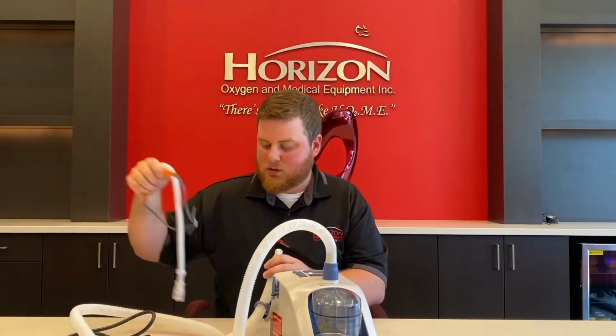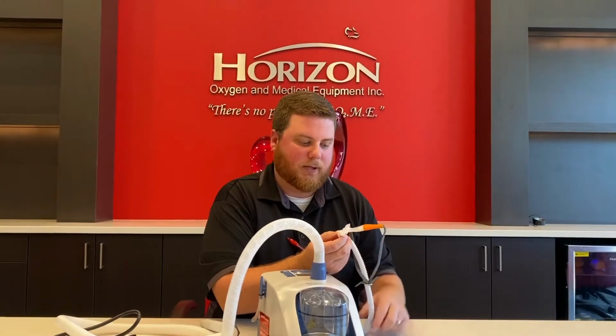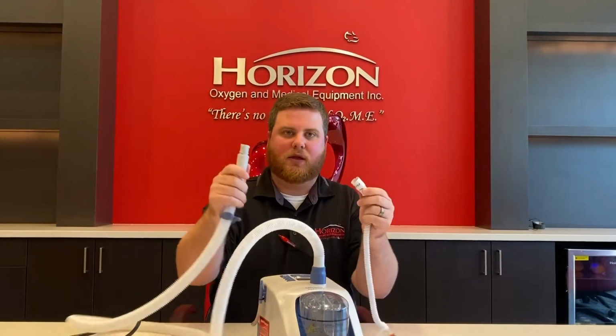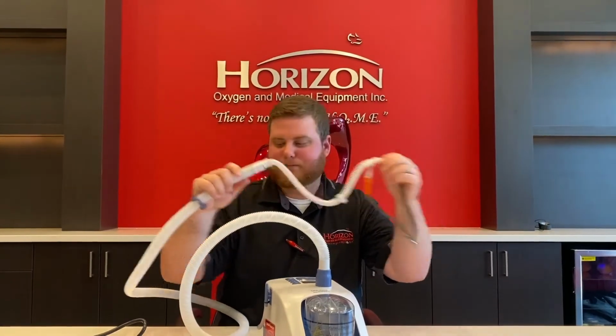Now, we can use this for most patients. They're going to utilize what's called the OptiFlow. There's a small, medium, and large: an orange one, a blue one, and a green one. The change in size is based on the size of the prong to the patient. This OptiFlow fits perfectly with the end of the tubing that comes with the Airvo. So we'll slide those in together, that snaps into place, and then we can put this onto the patient.